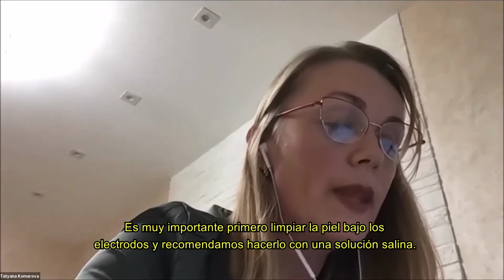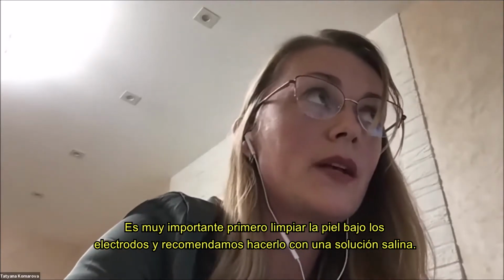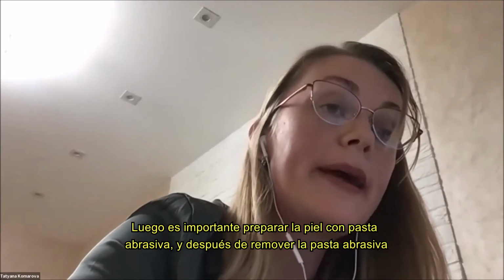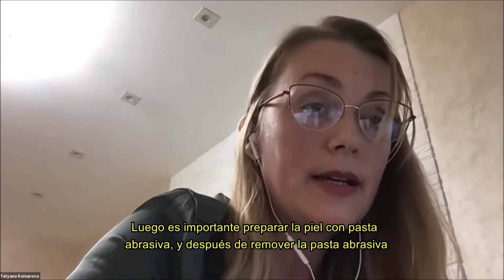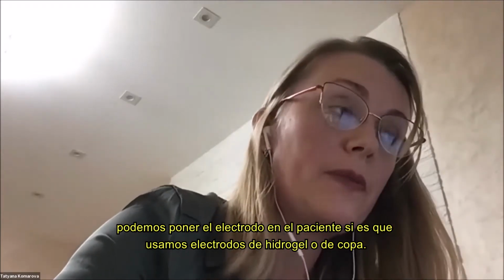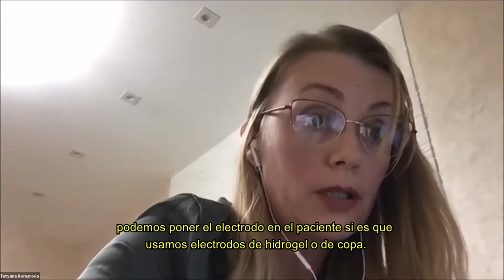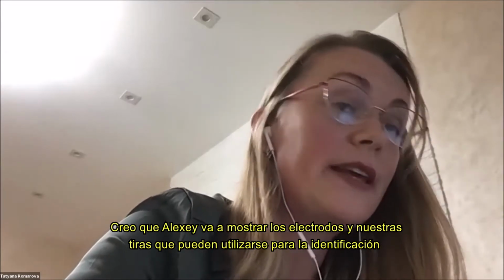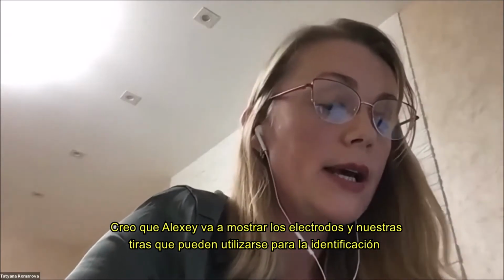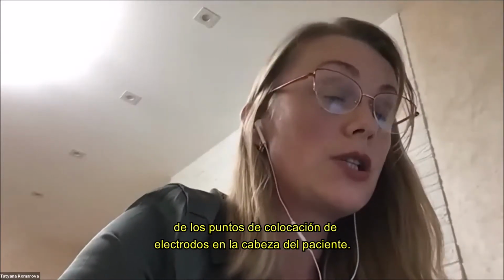We recommend cleaning the skin with saline solution. After that, it's important to prepare the skin with abrasive paste, and after removing the abrasive paste, we can put the electrode on the patient, whether you use a hydrogel electrode or cup electrodes. And I think that Alexey is going to show the electrodes and our strips, which can be used for identification of electrode points on the patient's head.